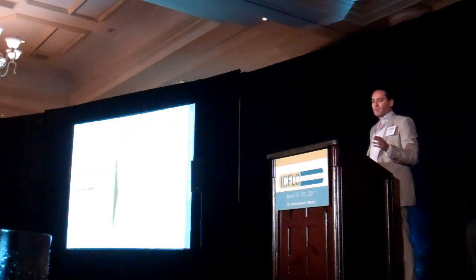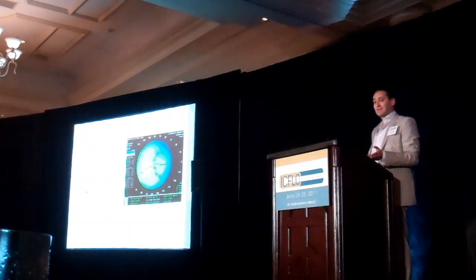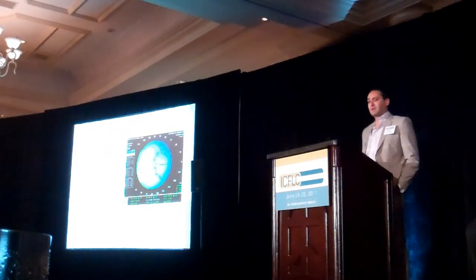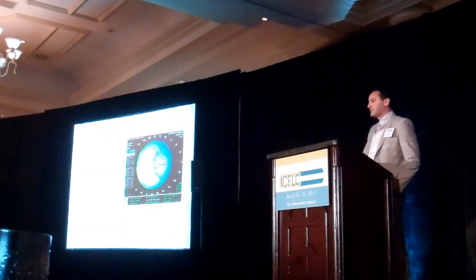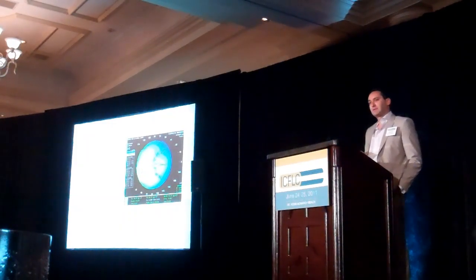So I think that really where this turns to is now optimizing our nomograms and optimizing the tissue response to a laser, which we have very good control over. This is one case of a sub-Bowman's arcuate incision of a patient who was treated at Bascom Palmer. This is a 61-year-old man who had a Tecnis multifocal, unhappy with vision, uncorrected vision was 20/50, best corrected 20/20. And you'll notice that the manifest refraction did not line up with the topographic amount of cylinder that was present.